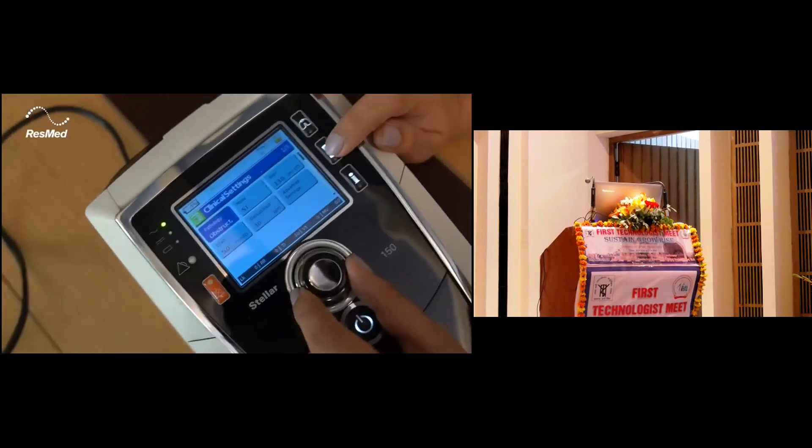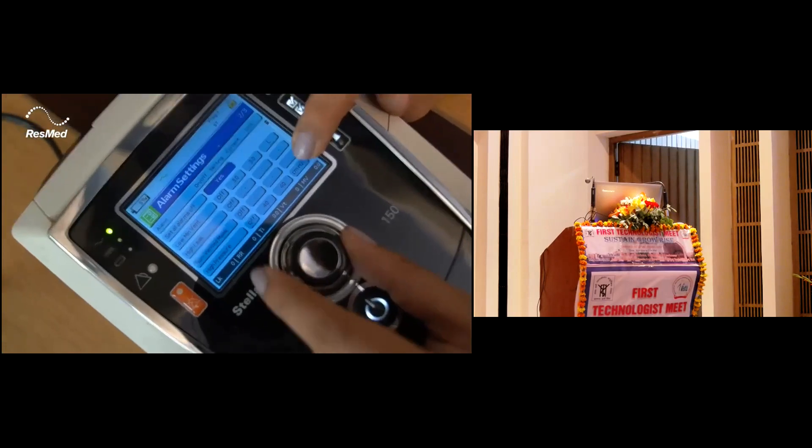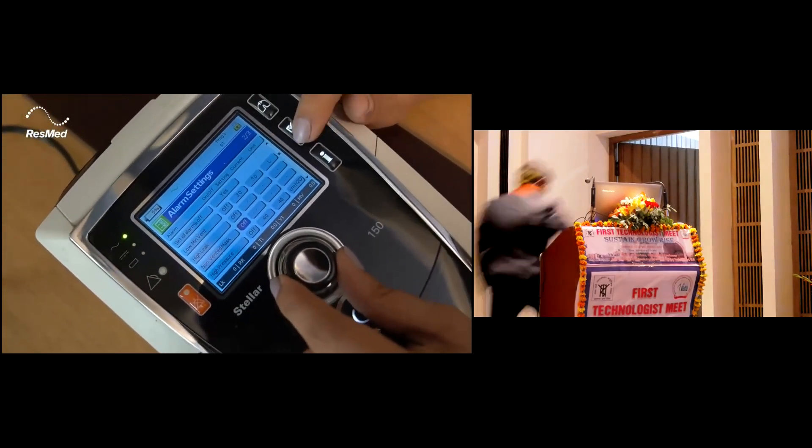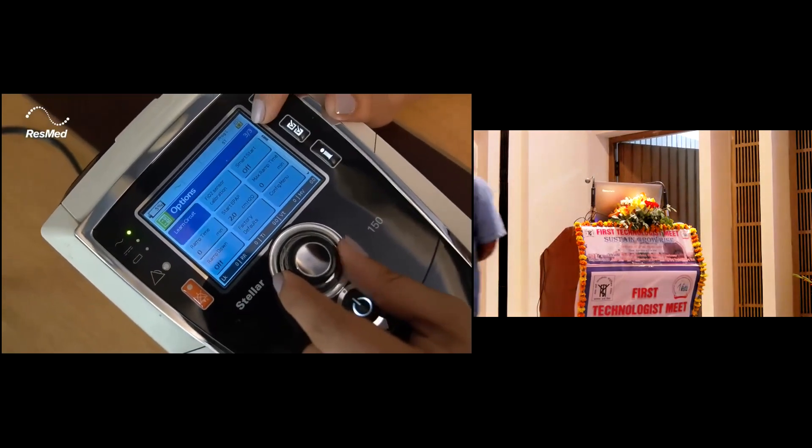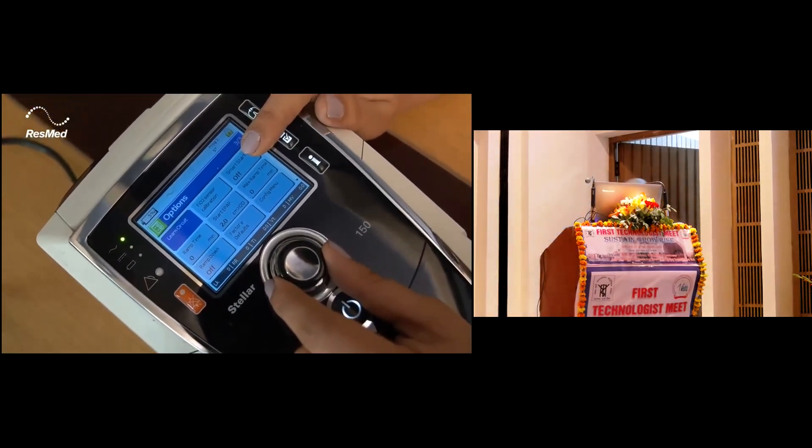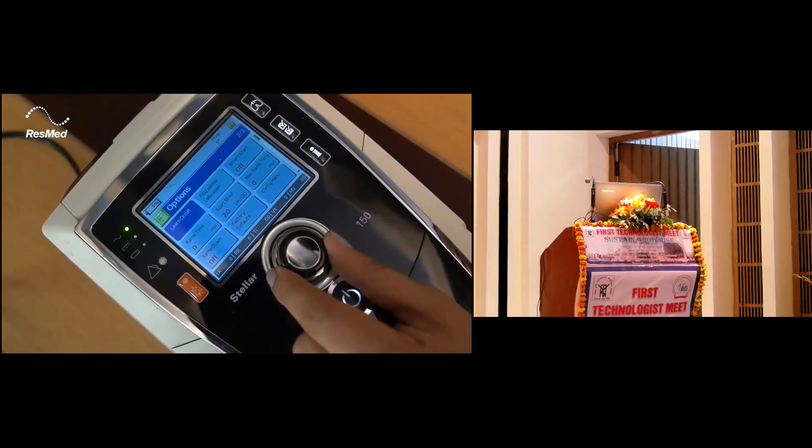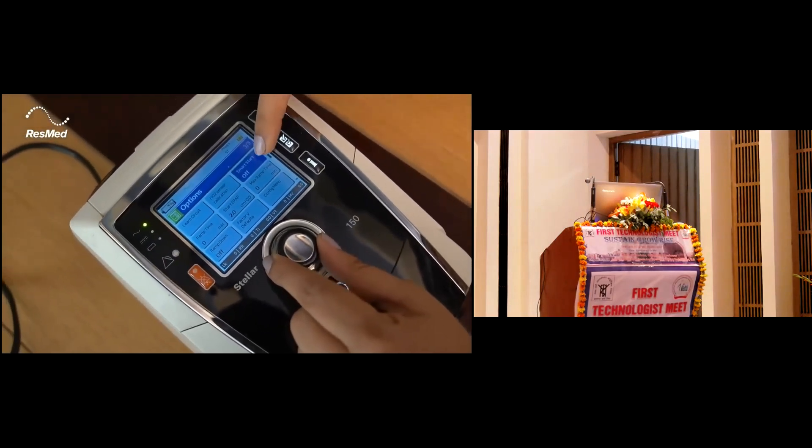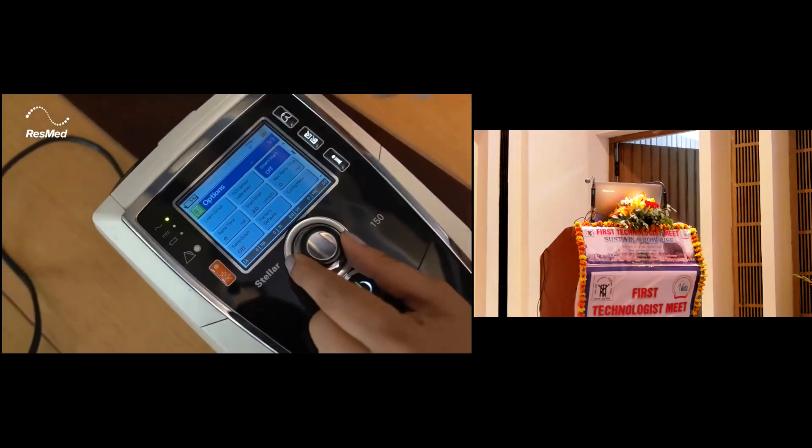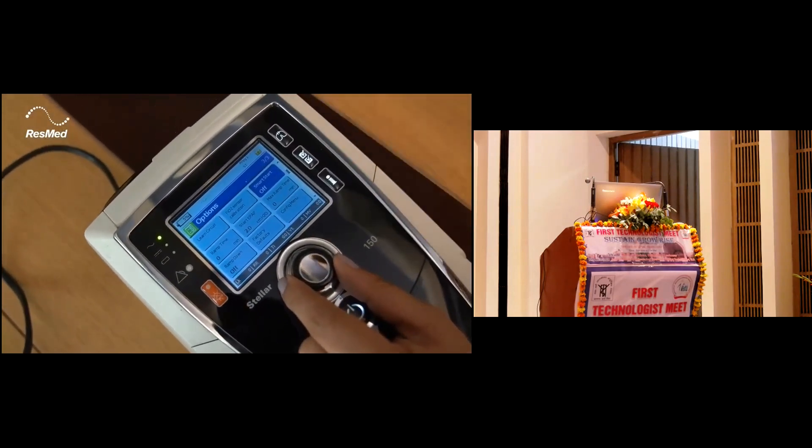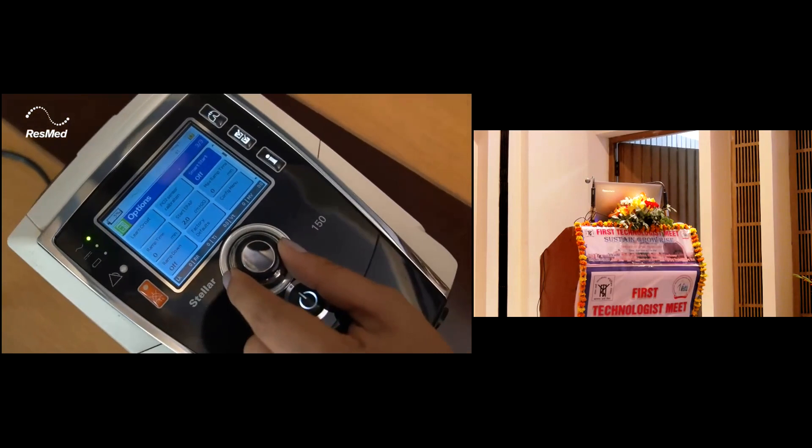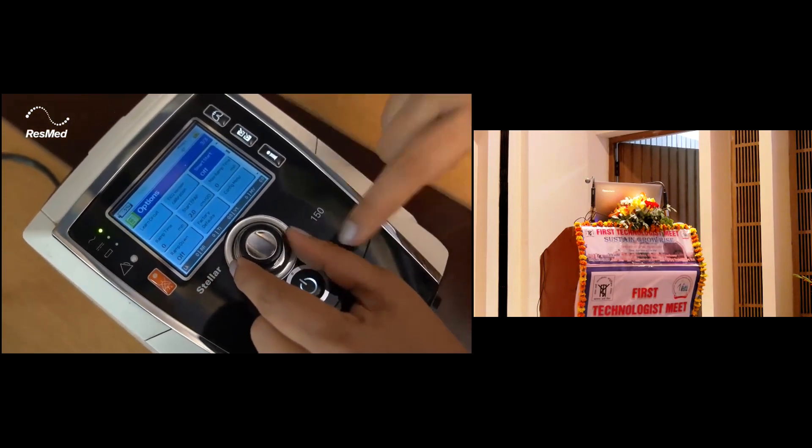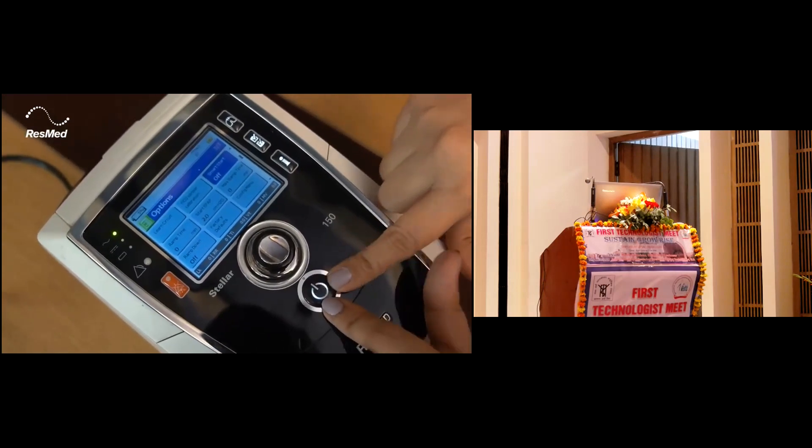If you click on these settings again, you can get the alarm settings. You can set the alarms as per your clinical requirements. On page 3 out of 3, you have other extra options like learn circuit, FiO2 calibration, and smart start. Smart start is a feature wherein the device can understand that the patient has worn the mask and start the therapy by itself without clicking the power on button.